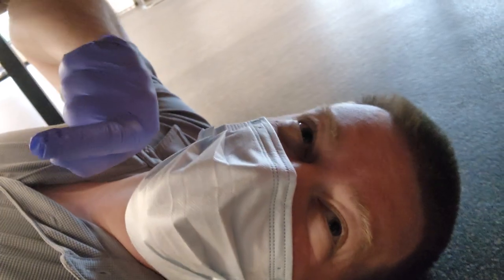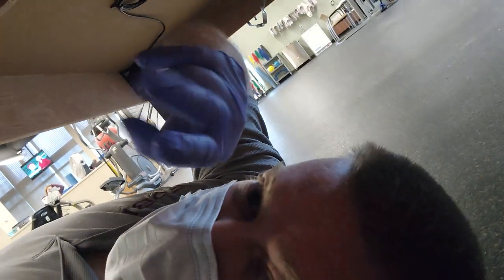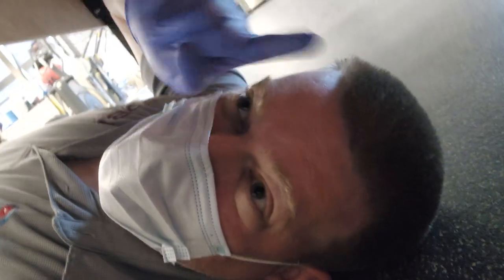I've never seen this problem before. So I am underneath a physical therapy table. You see, I have a hydraulic reservoir up here. There's the pump, and it's got these hydraulic lines that now run to pistons, like this guy right here. Each leg is a piston, and I've got one piston that is not moving.